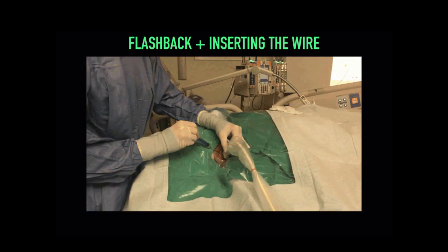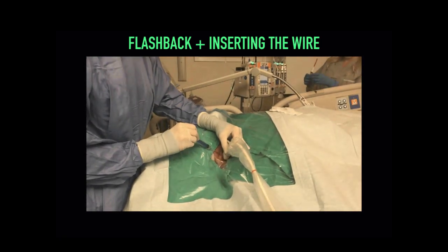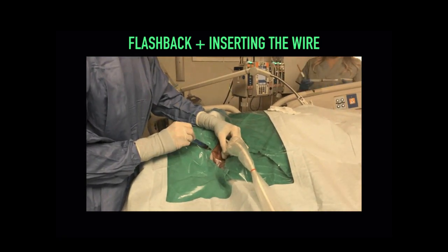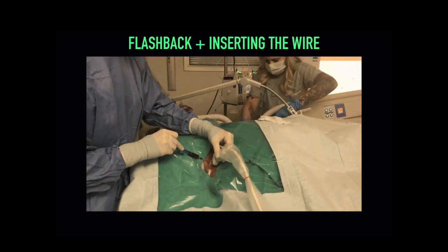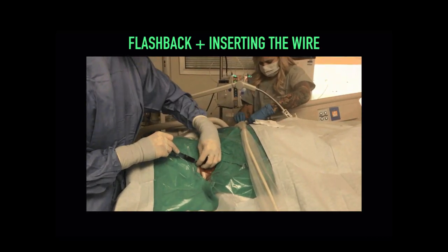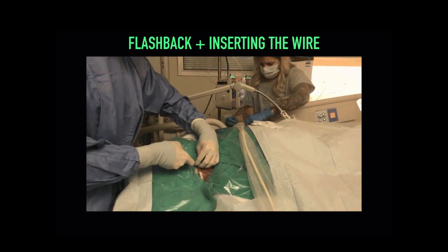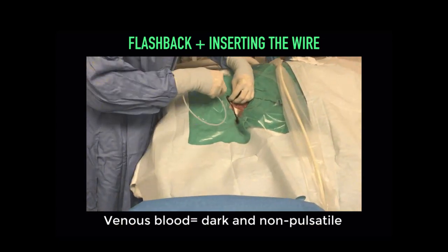The operator must carefully watch the barrel of the syringe itself and the screen, as once the vessel is penetrated, you will see a venous flash of dark blood, as shown here. The probe is placed down. The needle is stabilized with the left hand against the body of the patient. We can see dark non-pulsatile blood.